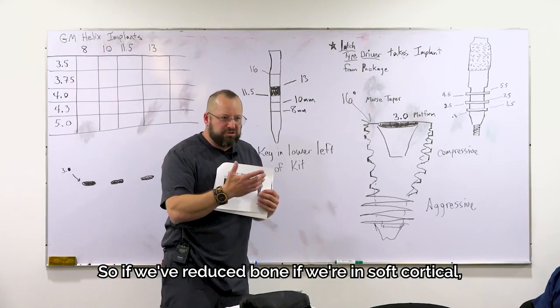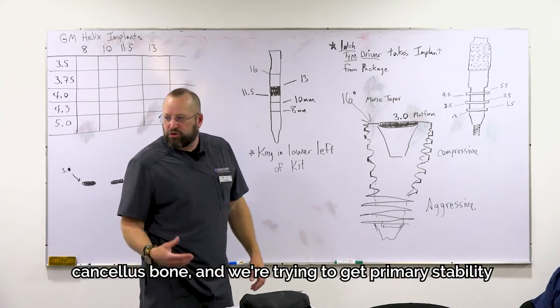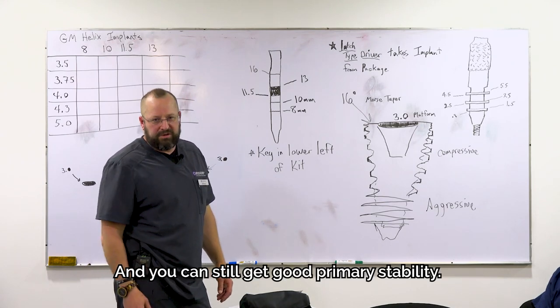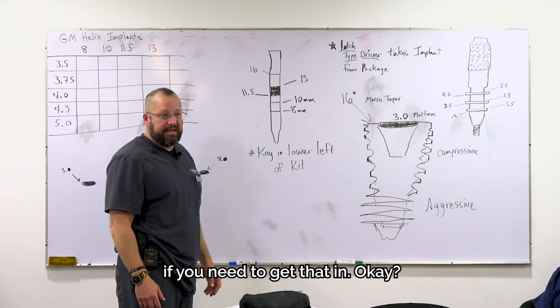So if we've reduced bone, if we're in soft cortical cancellous bone and we're trying to get primary stability, then you guys can twist this thing in with just the two. And you can still get good primary stability. That's how much you can undersize any of those first four diameters if you need to get that in.